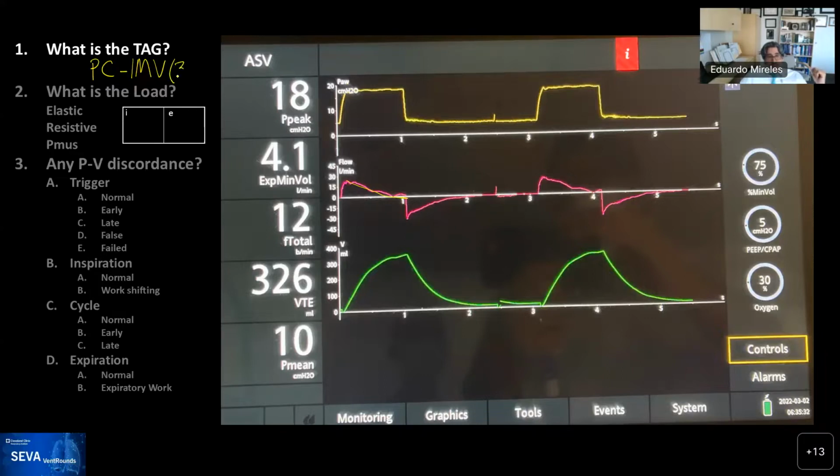Many of you recognize that this is IMV type 3, and actually I'll point out one of the items of ASV is, if you notice here, the caregiver enters the percent minute ventilation that the patient is going to get. You don't enter the tidal volume, you don't enter the rate, you enter the percent minute ventilation.